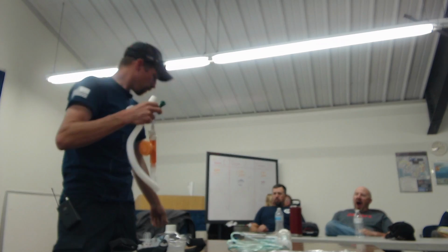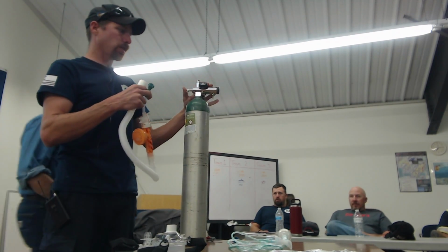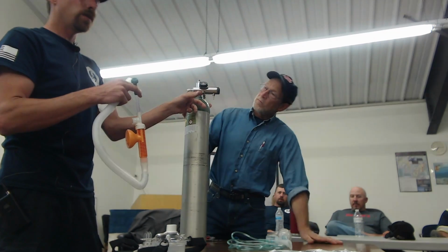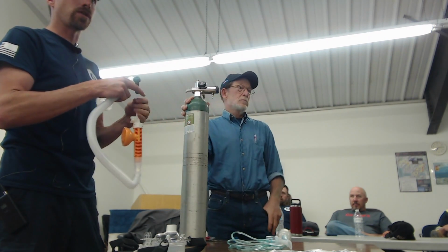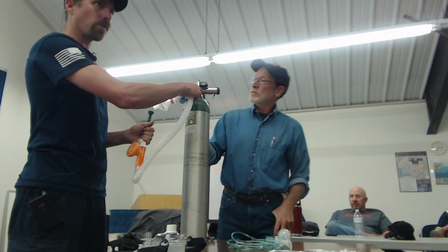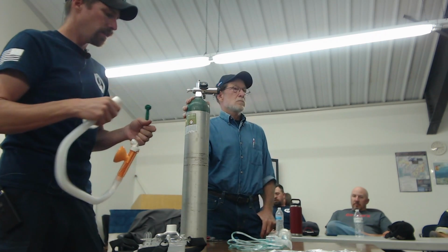So this end is going to hook into your oxygen supply, whether that be a portable oxygen supply, like on a bottle. The key factor here is if you use a portable oxygen supply, it is going to have to be a regulator with a high pressure port. You cannot hook it up to your regulated port. That will not supply enough pressure to actually operate the device. So you're going to be looking for this threaded piece on the side of the regulator. Make sure you grab a regulator with that.